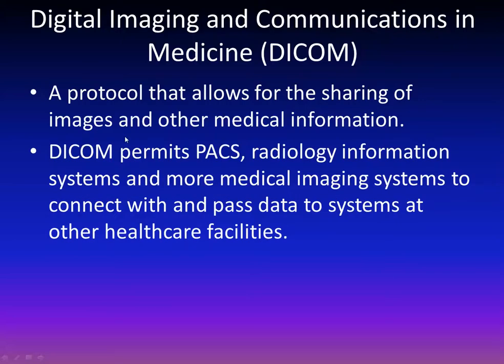Now I talked about DICOM, and DICOM is important because it is a protocol that allows for sharing of images and other medical information. It's a standardized format to do things. DICOM stands for Digital Imaging and Communication in Medicine. And again, it's going to allow you to communicate between the PACS, the Radiology Information System, and other medical imaging systems in a secure manner, in a reproducible manner, probably more importantly. It just gives you the standard for transferring that data.